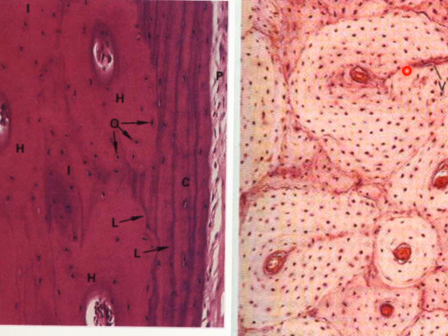If you have a label for this blood vessel, it's better not to mention Volkmann canal, because it is the anastomosing vessel passing in the Volkmann canal, and I cannot see the Volkmann canal, which is calcified tissue, in the decalcified compact bone section. So it's better to say anastomosing vessel passing in between two Haversian blood vessels. It's more correct than mentioning the name of Volkmann canal.